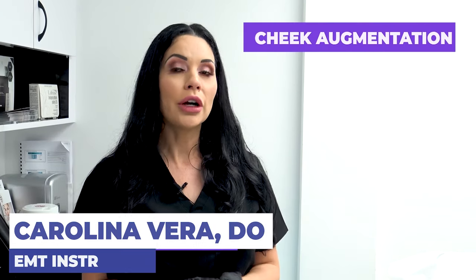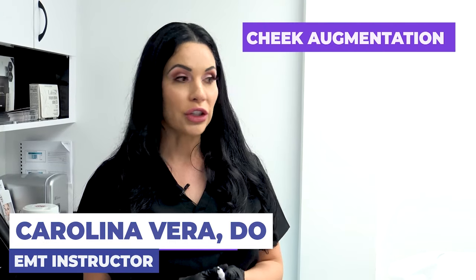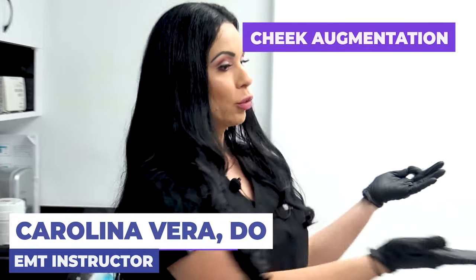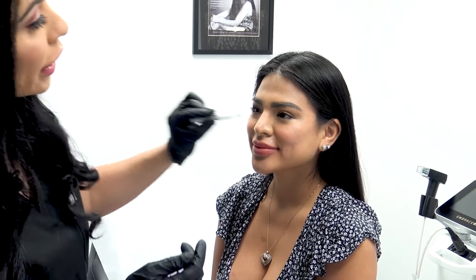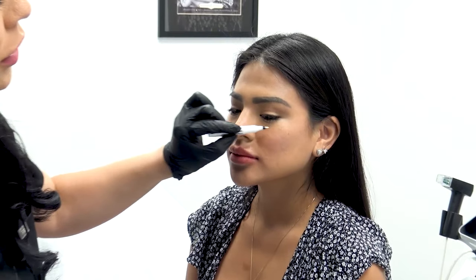We're going to be continuing our advanced dermal filler demonstration. We're going to be working with this young lady — she's almost perfect, but her concern is that she would like a little bit more of a medial cheek.